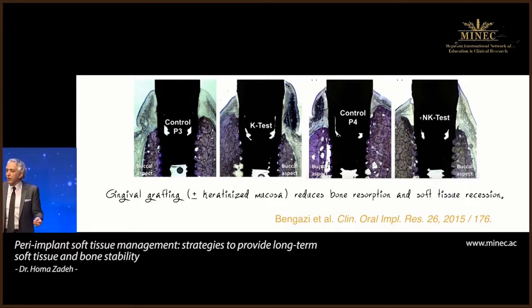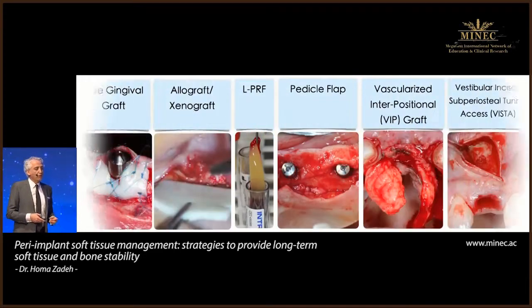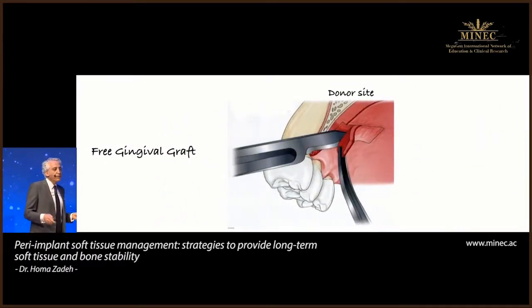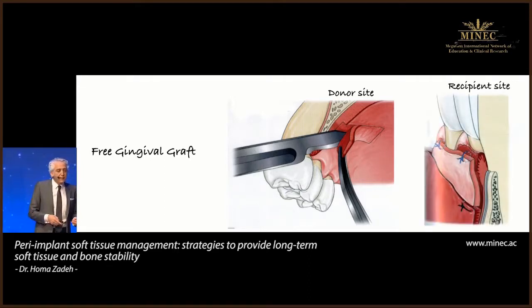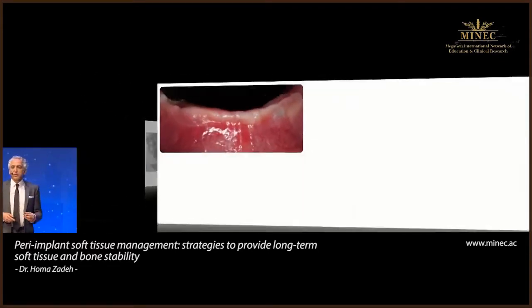So there's no right or wrong. It's a personal choice. If you want to use a free gingival graft, it works. If you want to use a connective tissue graft, it works. So there are different techniques, and I'll take you through some of these techniques. The free gingival graft is a very classic technique. The problem is aesthetics. You never want to do it in the aesthetic zone. This is one of my patients who had this procedure done, and all I could see when she smiles, very attractive lady, all you see is that tire patch right in the front. So it's not a good idea for the aesthetic zone.